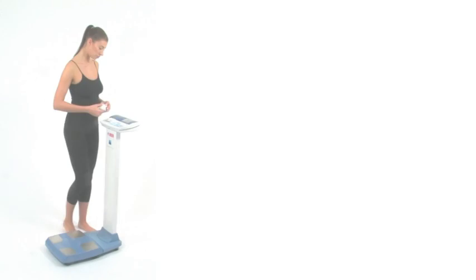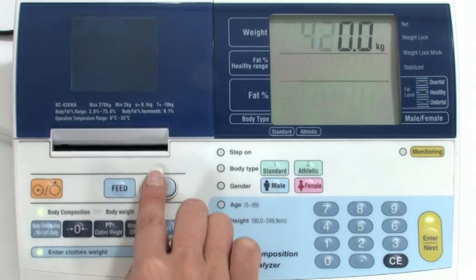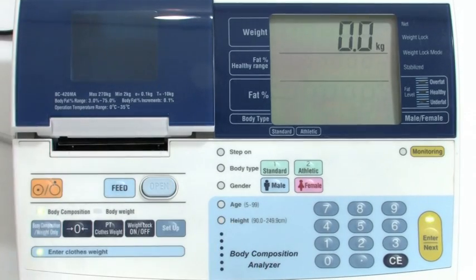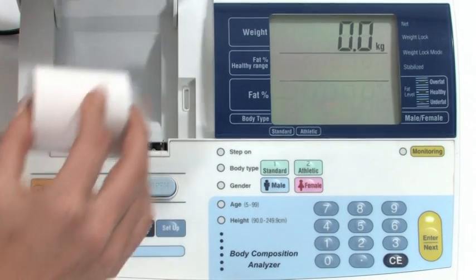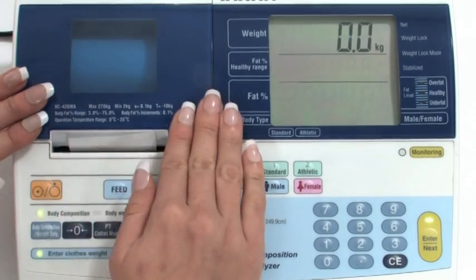To insert the paper roll, turn on the power. Press open and open the printer cover. You can then insert the print roll as shown. Once the paper is in place, close the printer cover.